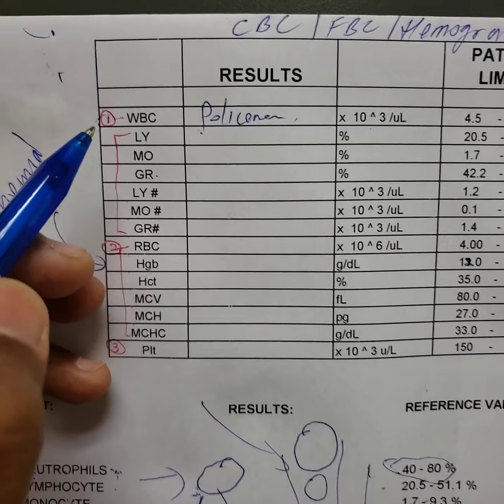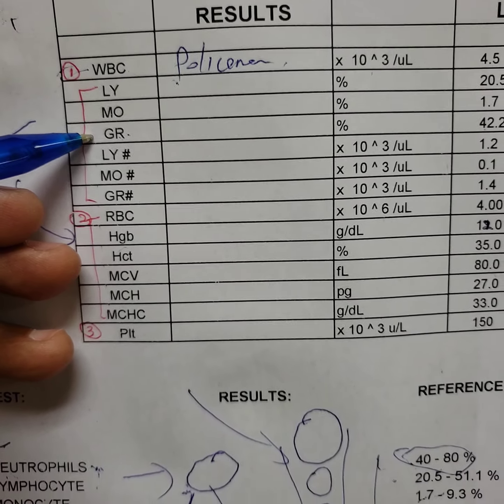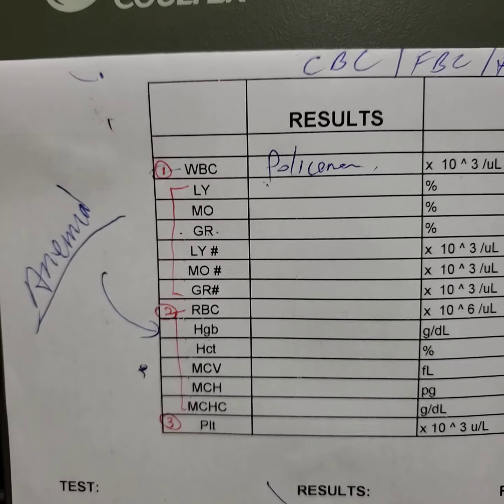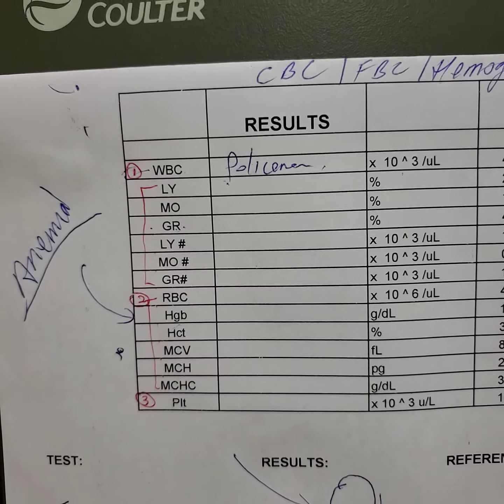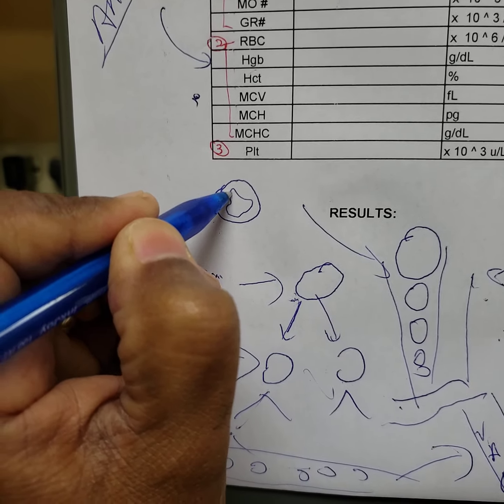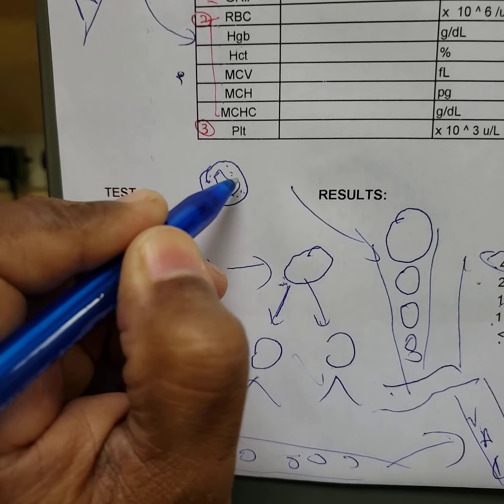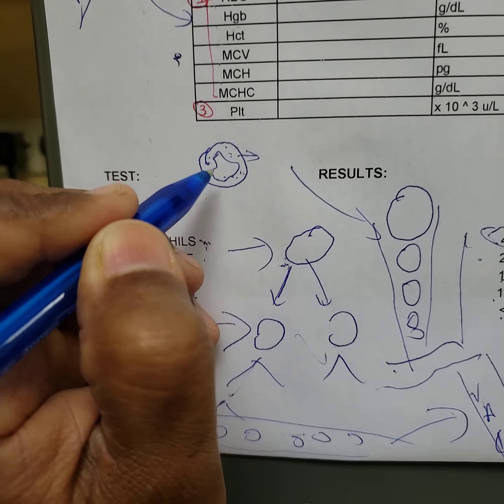All right. Here you see lymphocyte, monocyte, and granulocyte. Cyte, in medical terminology, is a word for cell. But you've got granulocyte, meaning a cell with granules in its cytoplasm. All these blood cells, guys, apart from the red cell, have a nucleus, and outside of the nucleus you've got a cytoplasm. This cytoplasm has granules, or it may not have granules.